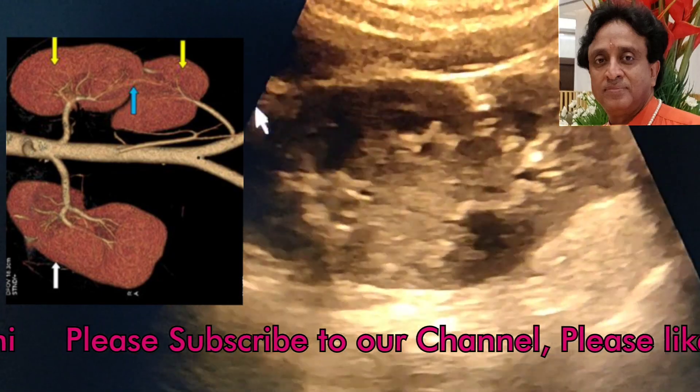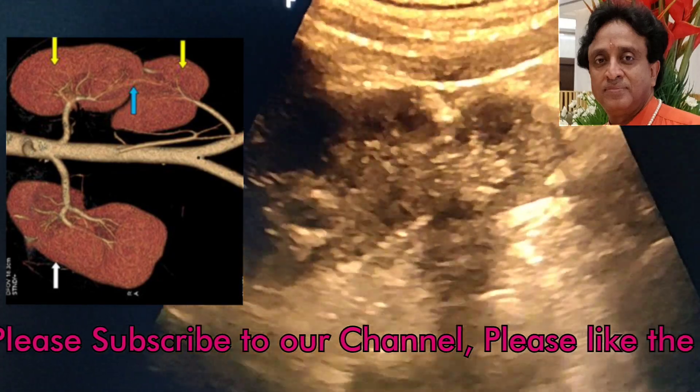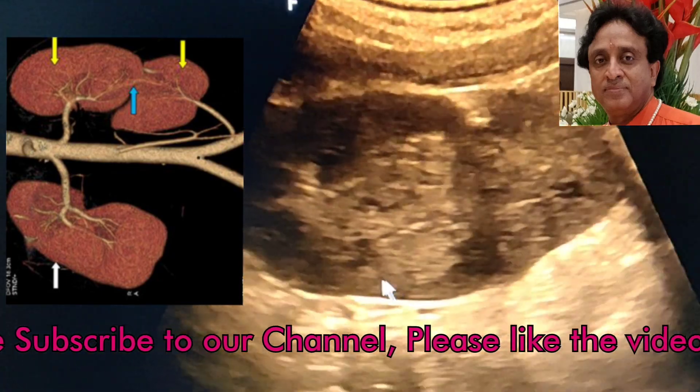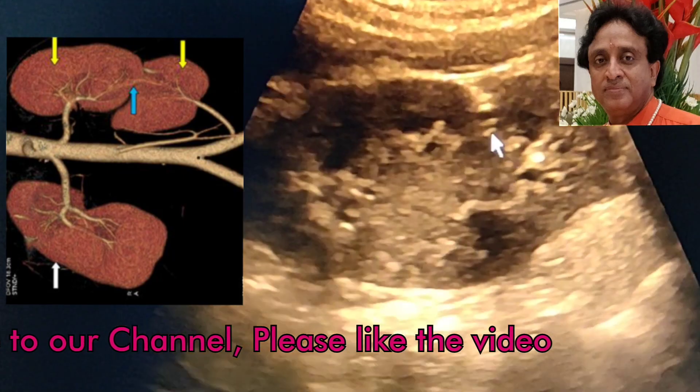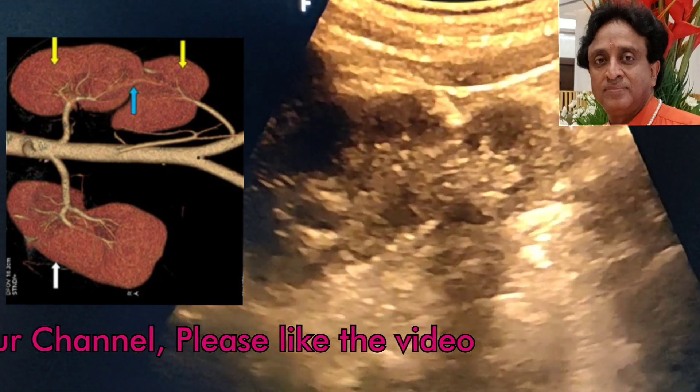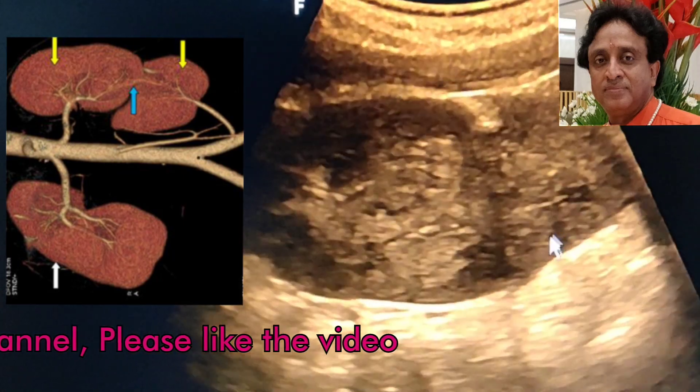We are saying that it is a supernumerary kidney because the primary kidney has its own separate capsule, and this second kidney too has a different separate capsule.